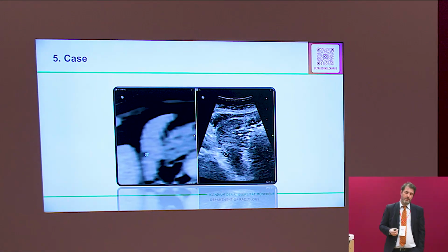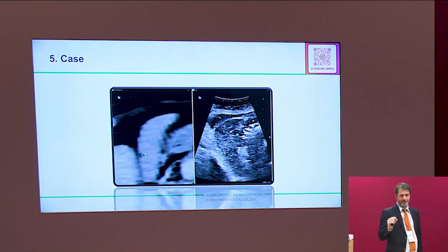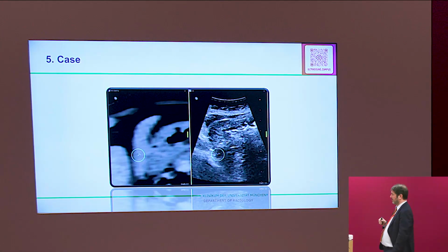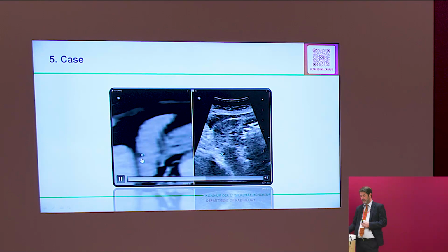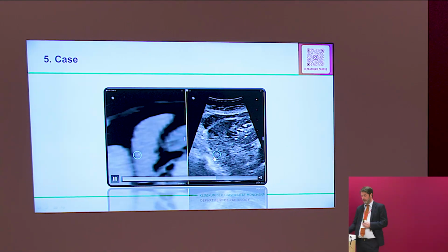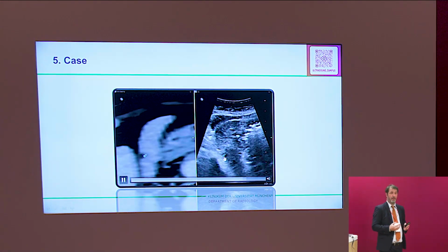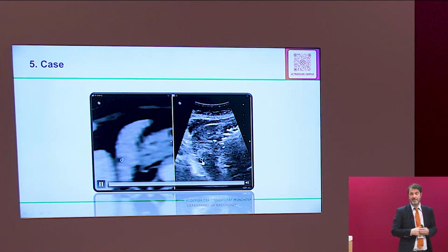Every time when we do fusion, we speak about, most of the time, very tiny lesions. That's the most challenging lesion. You see, there is a very, very tiny lesion here. And this is the lesion also in grayscale. What color does this lesion have in grayscale? Is it gray, is it black, or is it white?